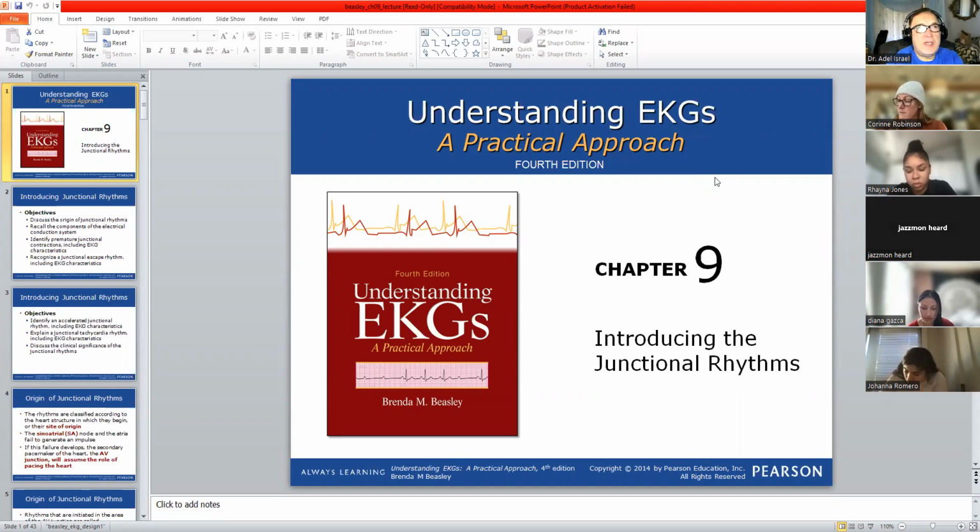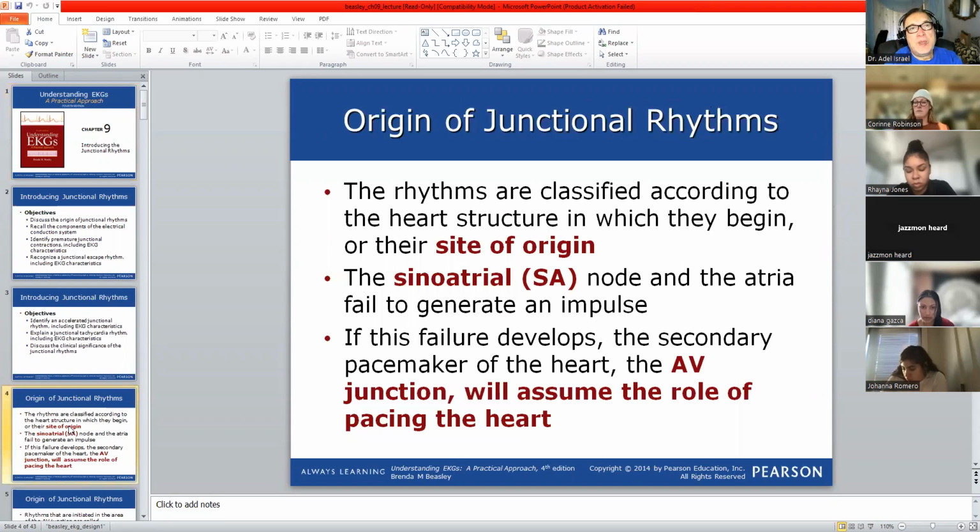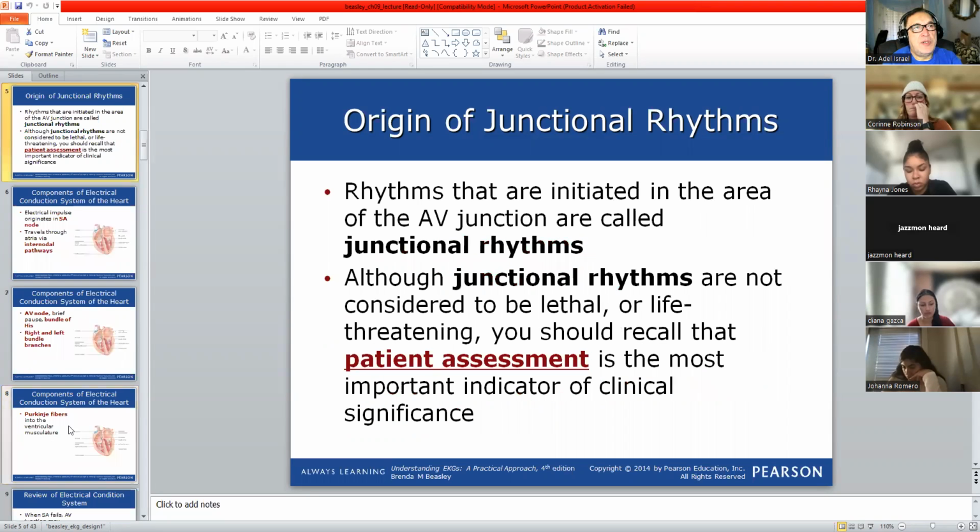What we need to know about this chapter is very nice. As I told you, each chapter we are going to have one word to guide us, the keyword to remind us about what we should find. If you put this information in front of you, you will find it easy to go with any strip if you follow the 5 steps which we mentioned before. Like we used all the time, the chapter is going to review everything for us.